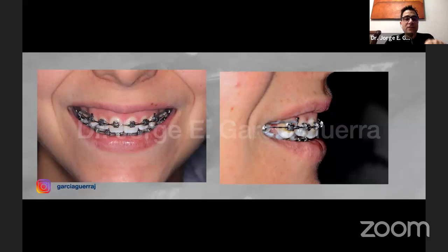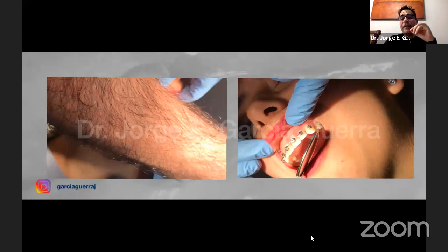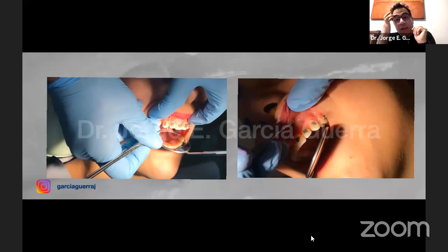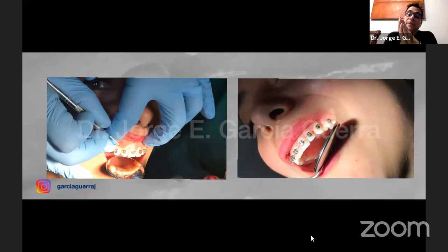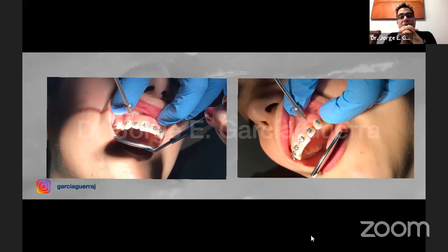So we placed some brackets. We placed some mini screws here. We have another video here. Between the canine and the lateral incisor, so we can start intruding the anterior part. Now, as you can see, the first thing that I always do, I use the periodontal probe to visualize the position of the roots. Then we visualize where we have the mucogingival junction, and we start putting the mini implants. I always use 1.5 diameter by 8 millimeters long implants in the anterior part.